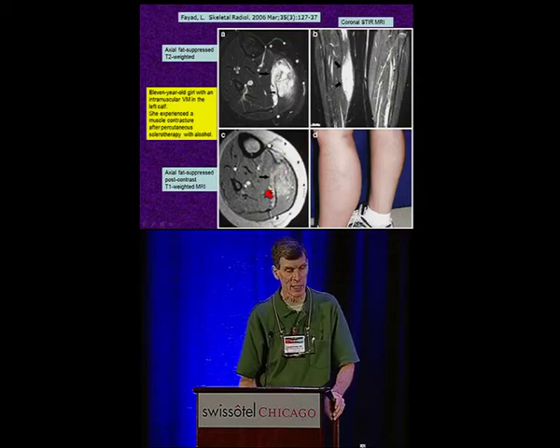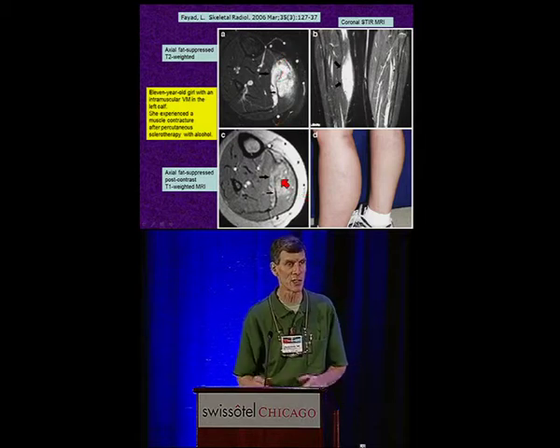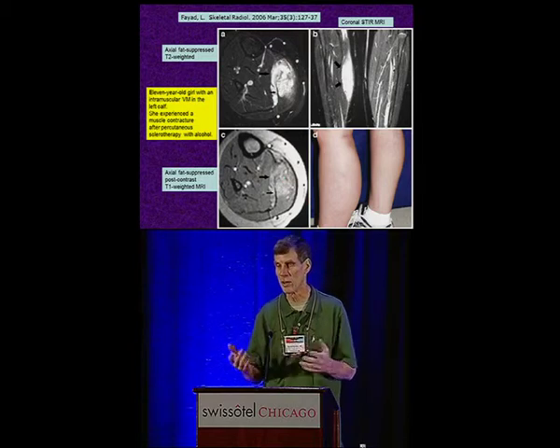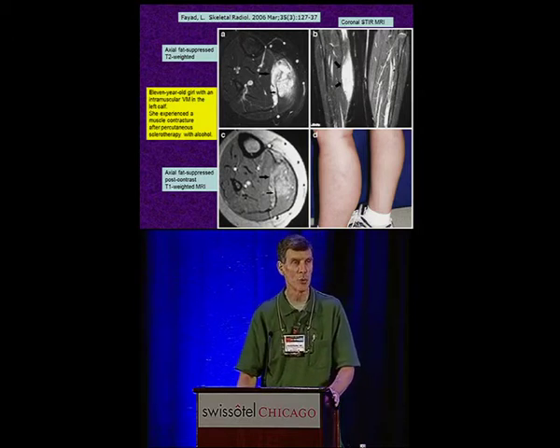They did a post-contrast T1 sequence where they did add contrast, but what you can nicely see is that the contrast-enhancing portions of this match up precisely with the T2 high signal components, so it's all vascular. There's no lymphatic components, there's nothing that's scarred, there's no stroma.